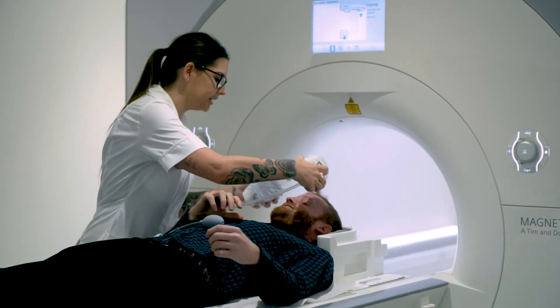Once we're happy with that, we'll bring the bed up, place you into the middle of the scanner, and the scan will last between 15 minutes to an hour.